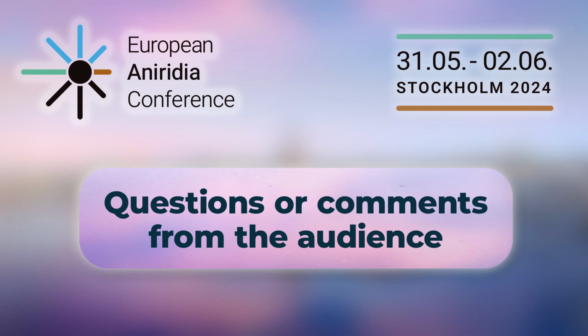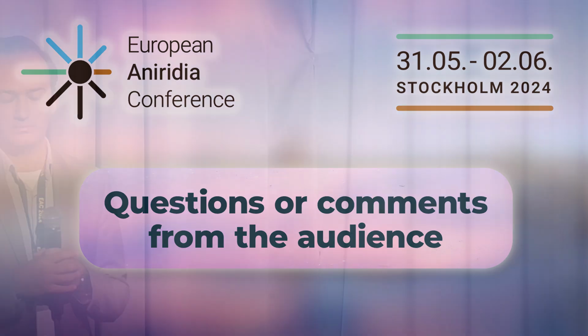Thank you very much for the presentation. I have a question. For the aniridia patients, we have understood that it's good to not use contact lenses because of the sensitive area of the limbal stem cells. And I wonder, have you thought about that? Is it like the material that allows it to be used for aniridia patients, or?